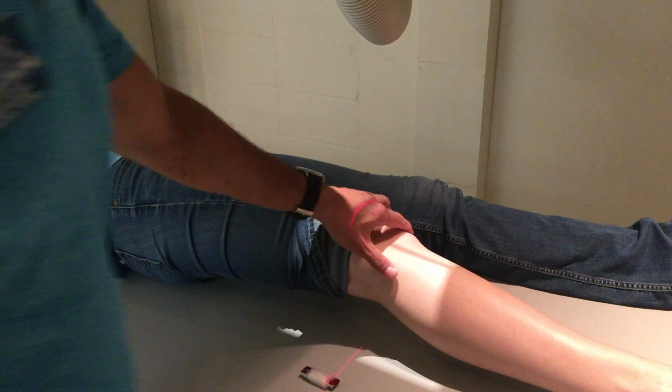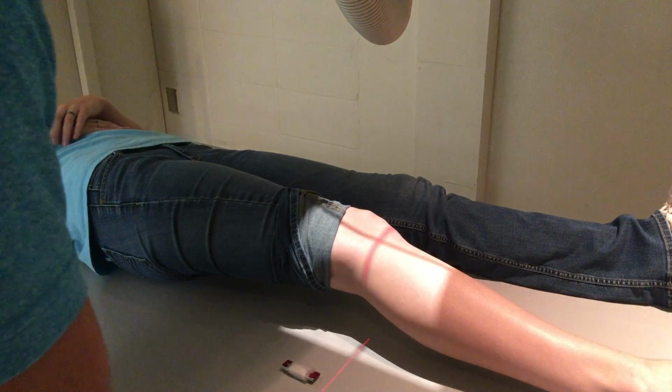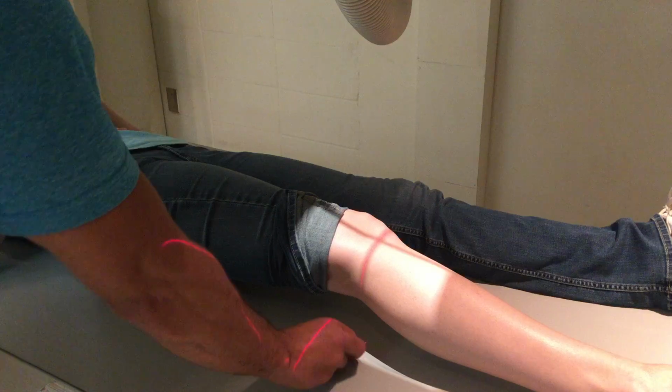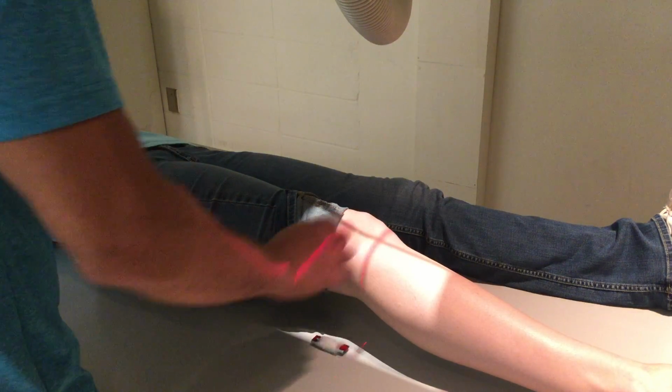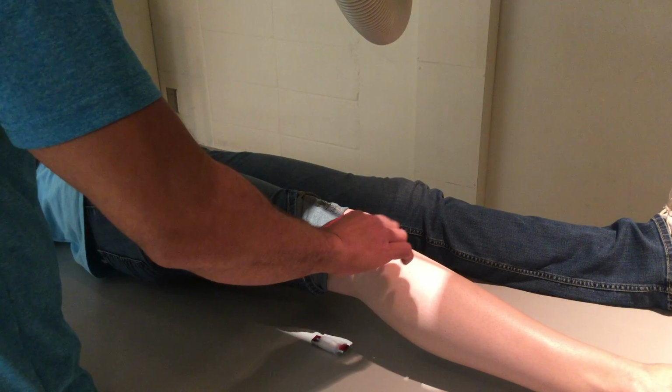Your centering's virtually the same as far as superior to inferior, but you'll notice that there is a shift when you roll in, so you've got to make your adjustments. The goal of this one is to open up the fibular joint space here between the fibula and the tibia.